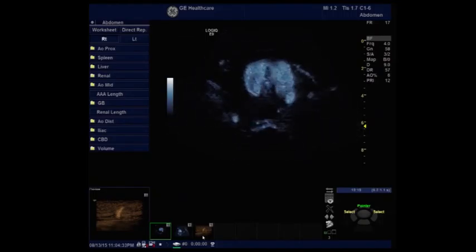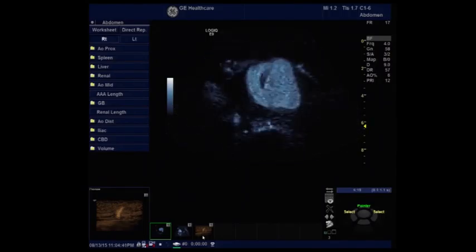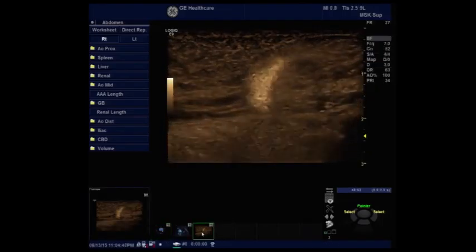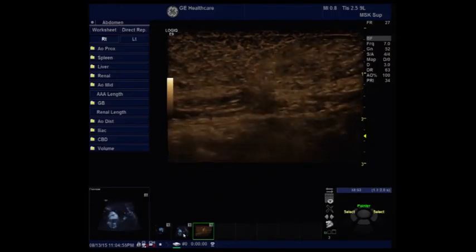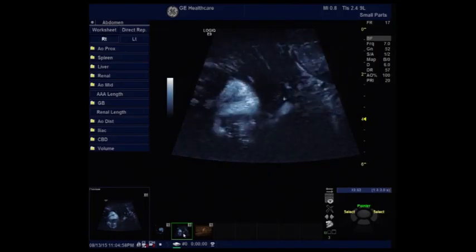The to and fro flow within an abdominal pseudoaneurysm, as seen here, is well visualized with B-Flow. B-Flow can also be used in cases to detect movement. For example, as we look at this image of an umbilical hernia, B-Flow was used when doing the Valsalva maneuver to assess the hernia. B-Flow may be used in detection of peristalsis in the bowel.